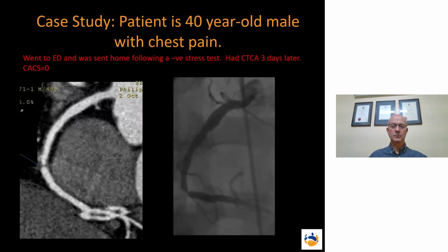You have someone here who had symptoms, and then he had a negative stress test. And this guy was on the edge of having a major coronary event. Fortunately, the GP did the right thing. He had his CT coronary angiogram study, and there's the stenosis on the angiogram. So my question back to GPs as a whole is, is the $600 to $800, $900 for the CT coronary angiogram worth it or not? Well, I guess in this guy's situation, it certainly was.